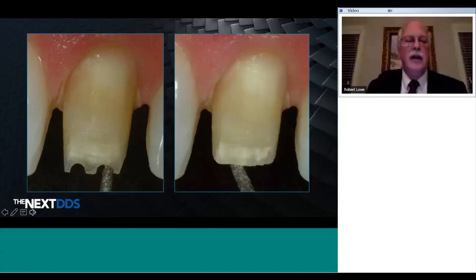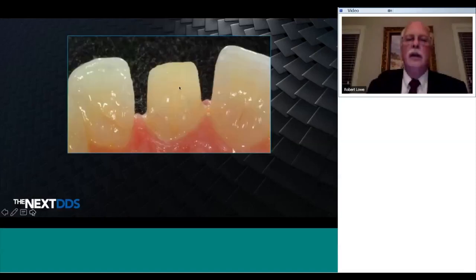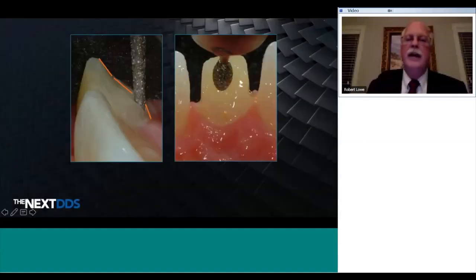Incisal reduction on an anterior, 1 to 1.5. The incisal edge on an upper incisor forms an acute plane because the lower incisal edge is going to come downward and forward. It's the opposite for a lower. Lingual preparation: depth groove down the center of the tooth following the lingual concavity, and then take the elliptical burr and remove the tooth structure on each side of the depth cut.